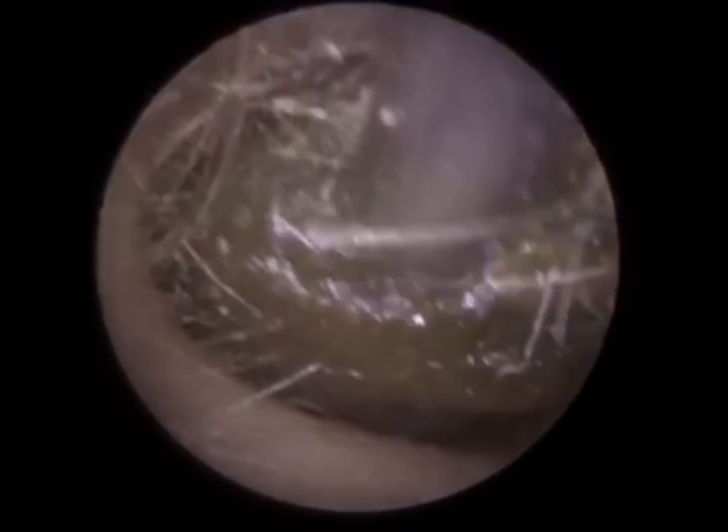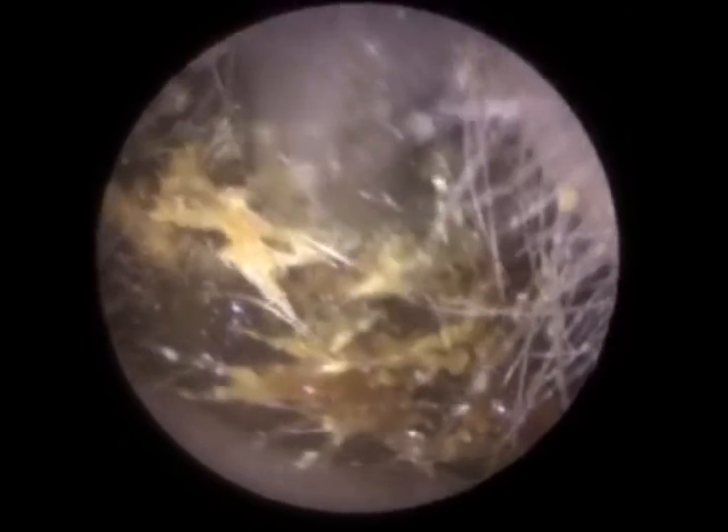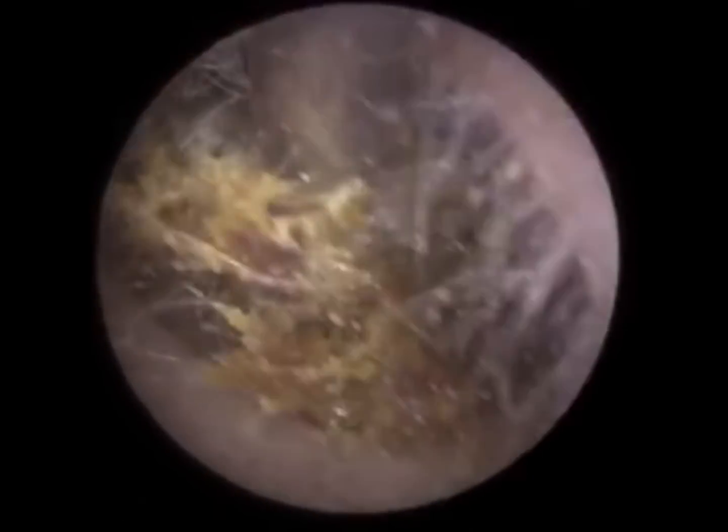It's moving around. And in the ear canal, there's 2 bends. You get the first bend about 0.5 centimetre in the ear canal, and the second bend is around, say, between 1 centimetre and 1.5 centimetres. So we're just trying to now rotate this around the first bend. So I'm bringing the wax towards the left-hand side of you, and then that enables the wax to come out straight of the ear canal, just with little circular motions.